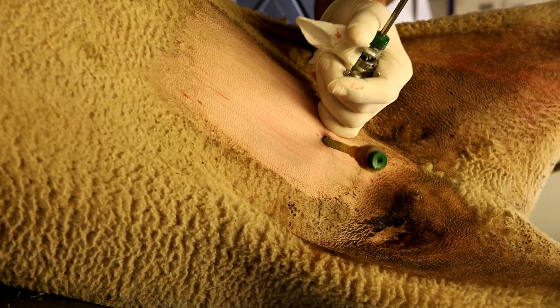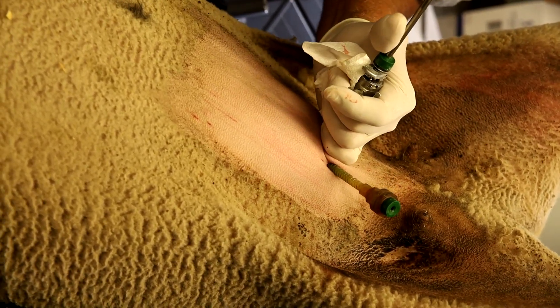Okay, anybody want to look in there? There are pink, curled-up things right there — that one faces me and one faces me.